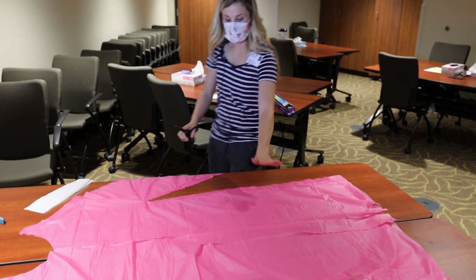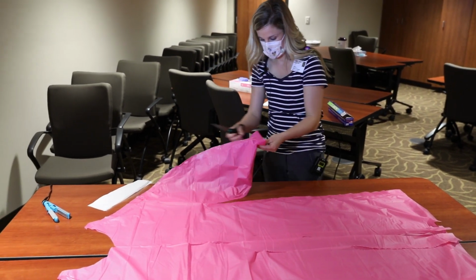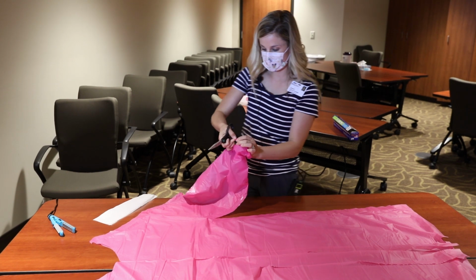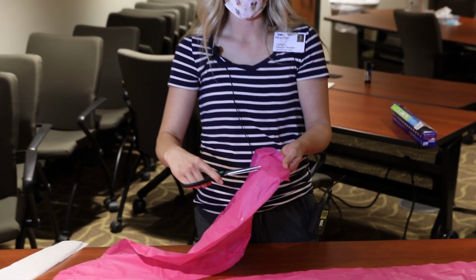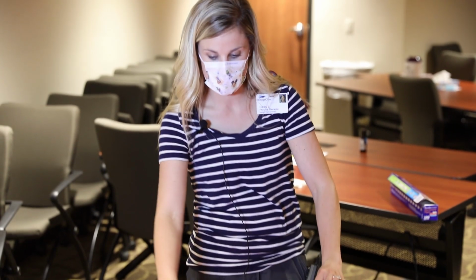So again, this is the back of the gown and it's face down. So we'll turn this over, twist a little piece and cut. And then you have a little thumb hole and you'll do that on this side and over here. And then lastly, we'll show you how to fold these gowns.